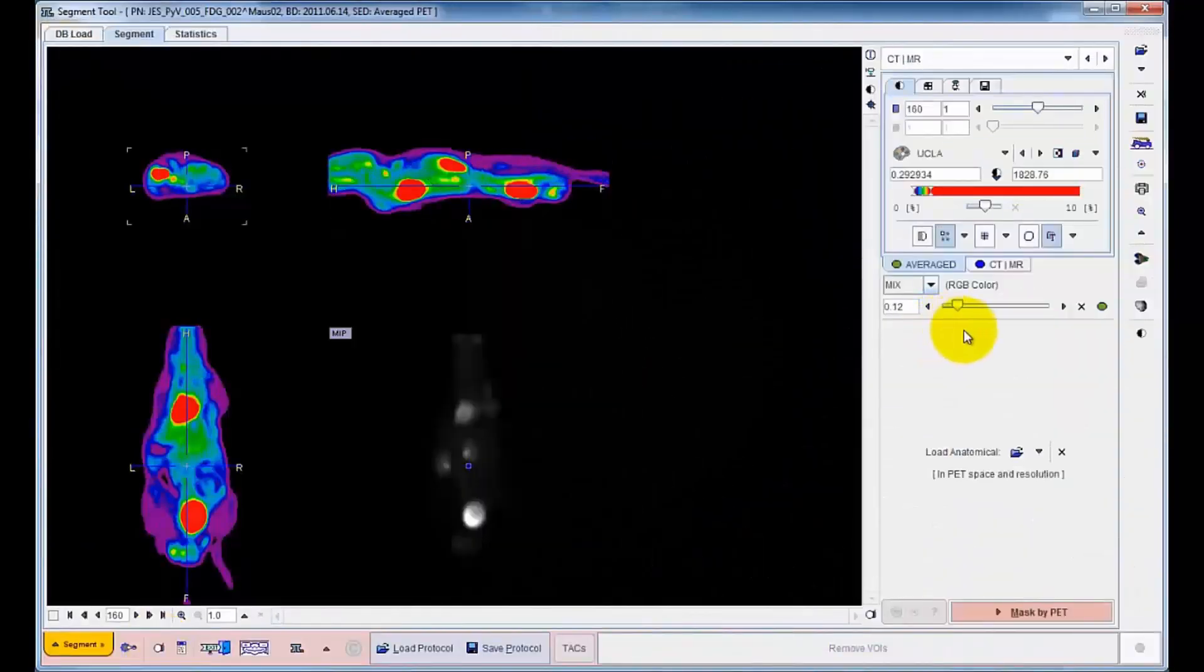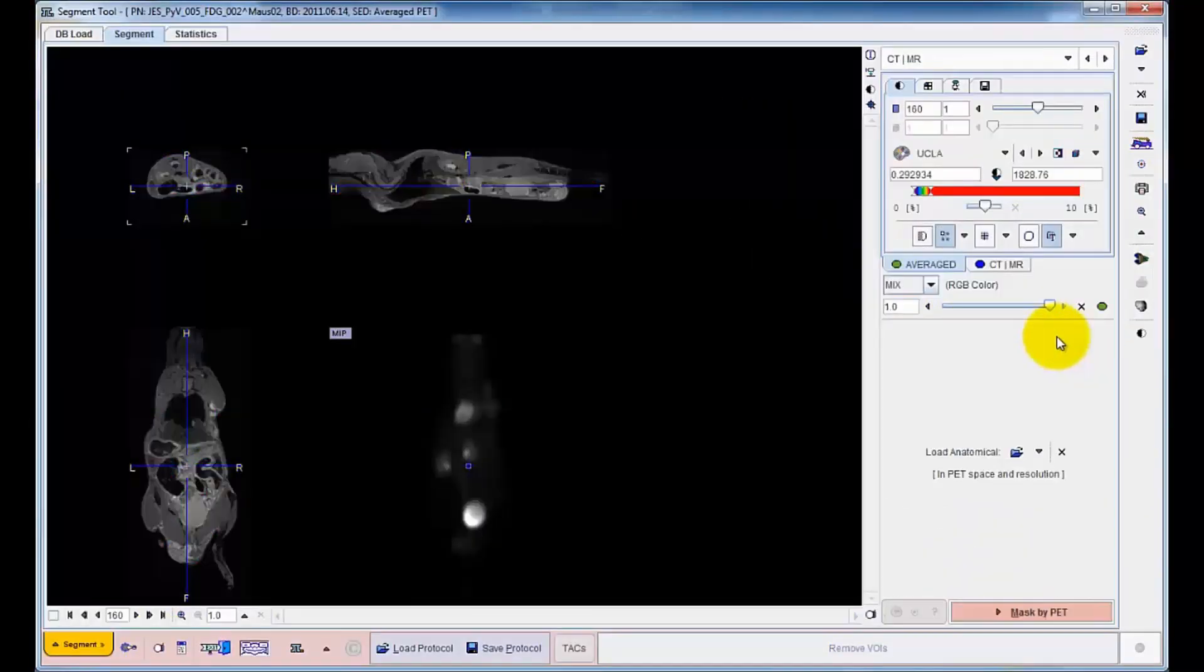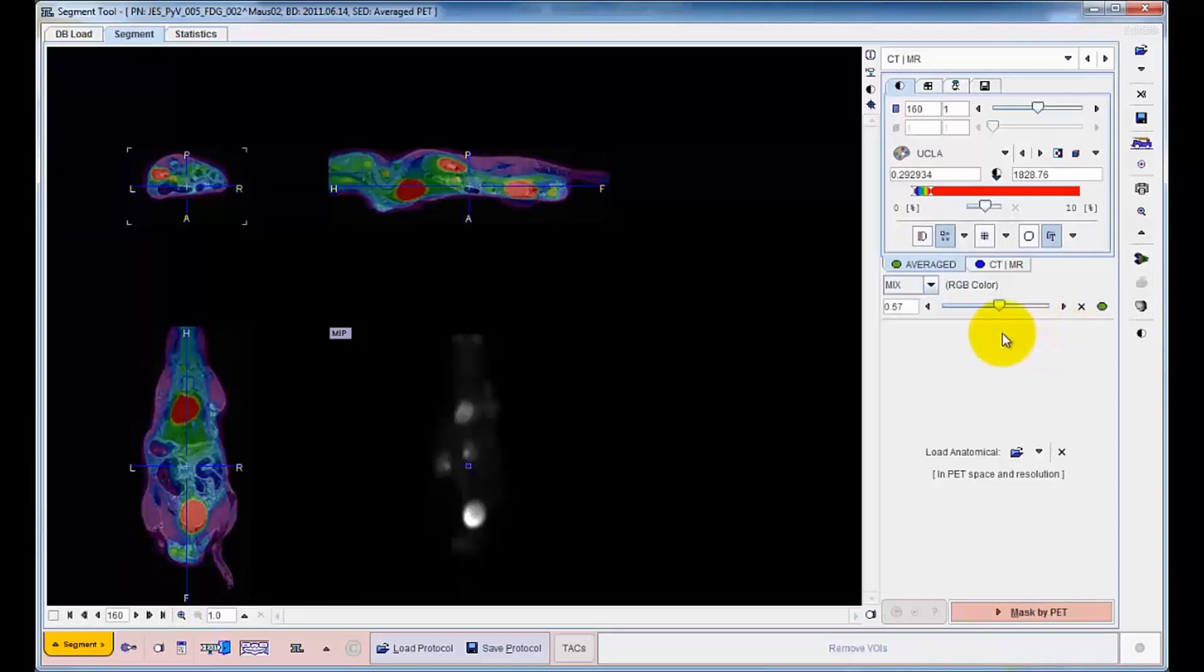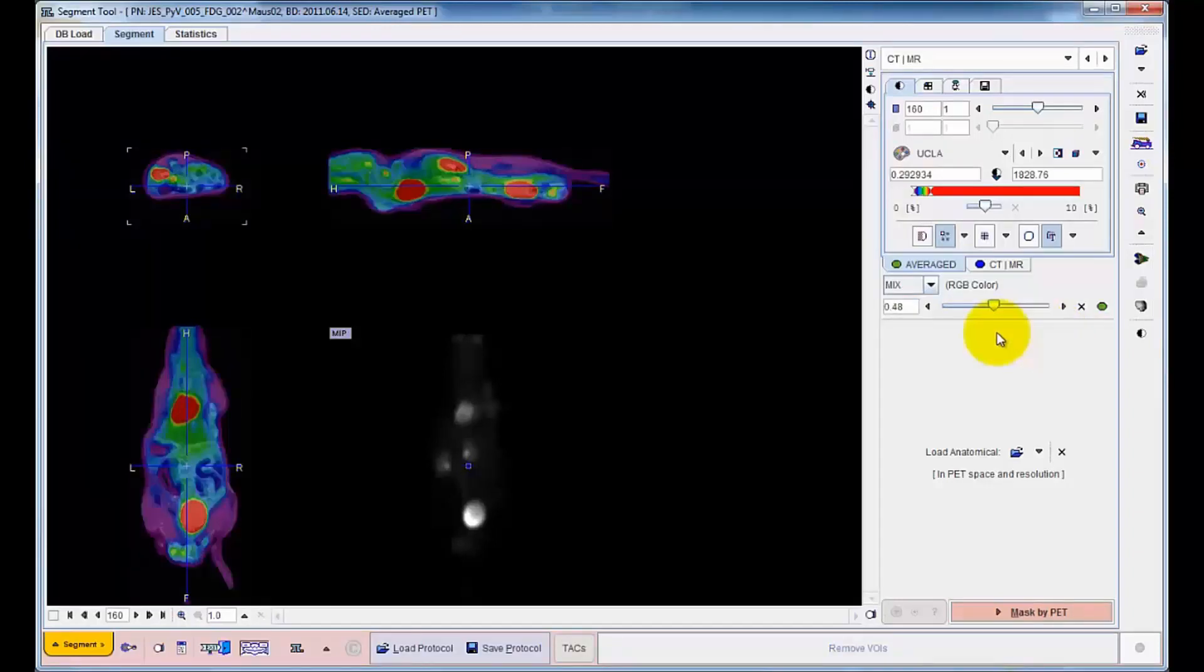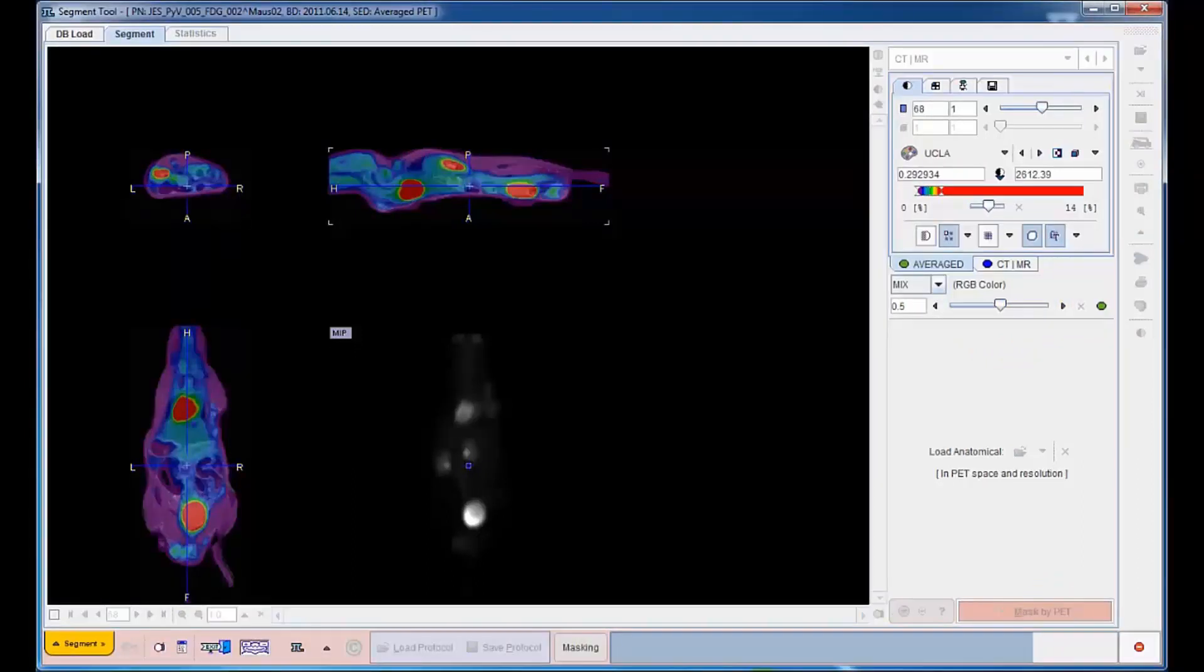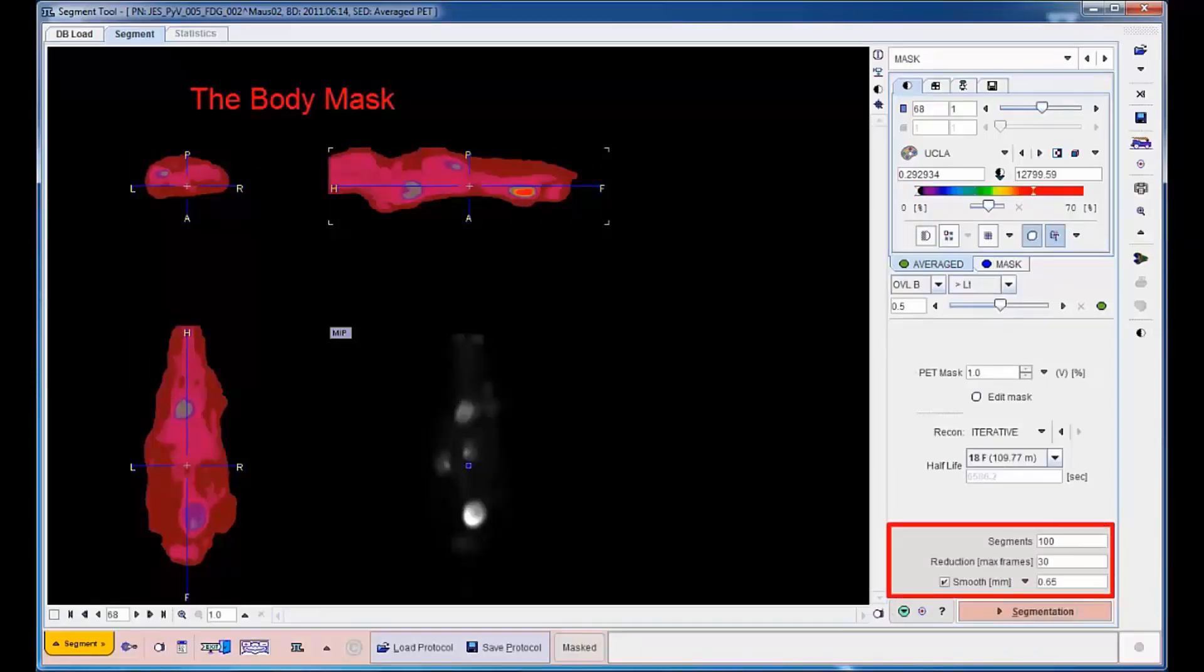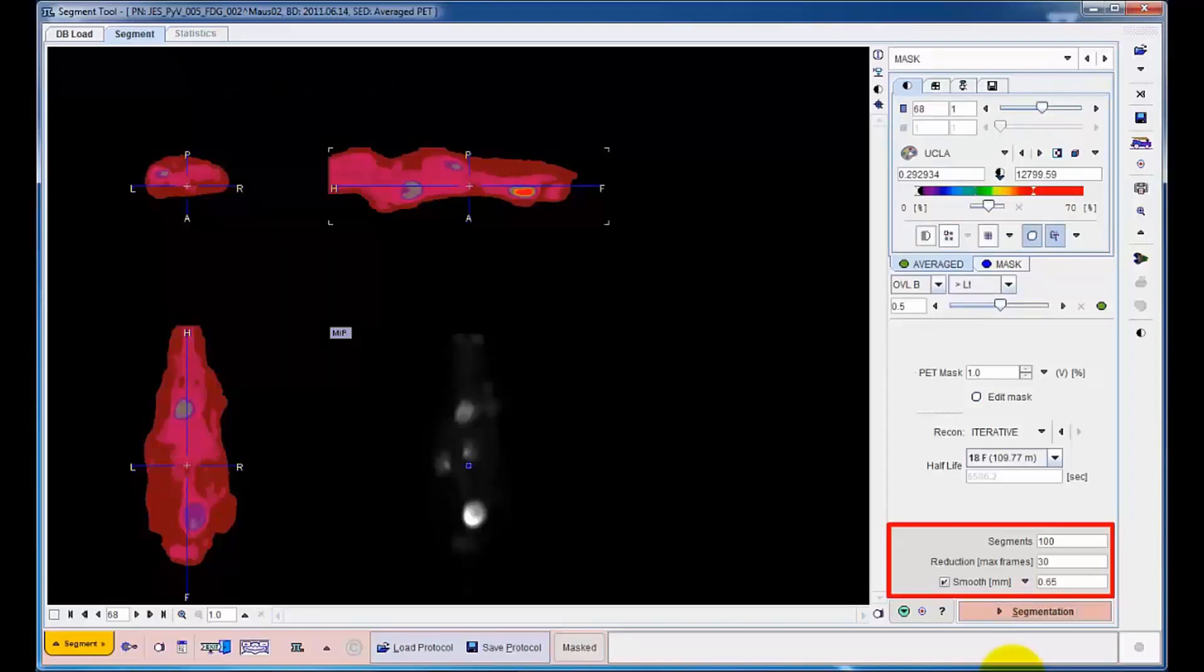Segmentation will group pixels in the PET image according to pharmacokinetic similarity and neighborhood. In order to exclude background from this process, a body mask is derived from the PET information. The segmentation algorithm is then configured with minor smoothing and a maximum of 100 distinct segments and started.